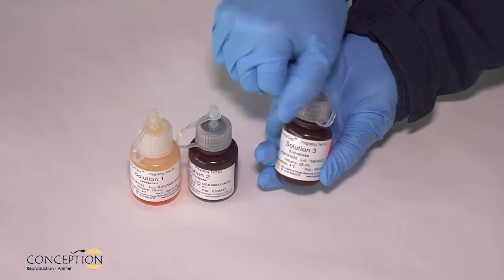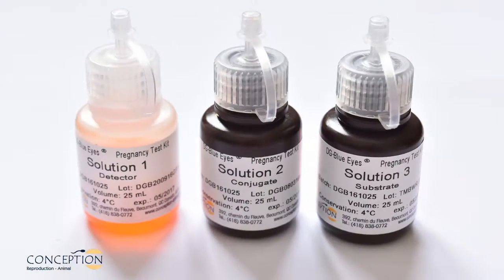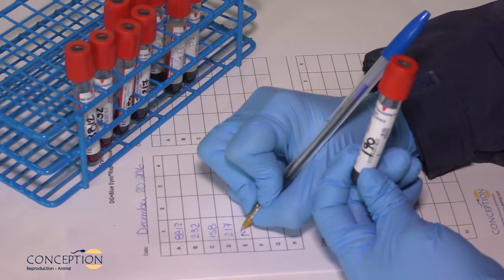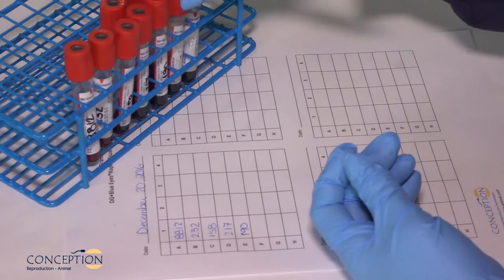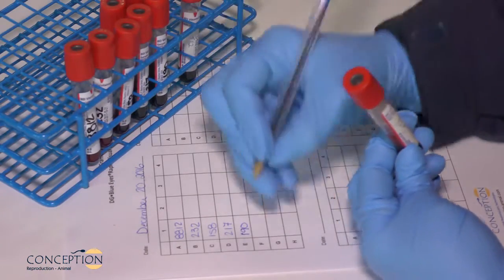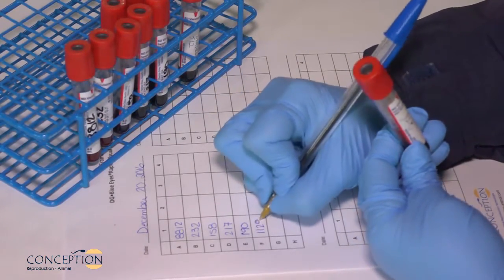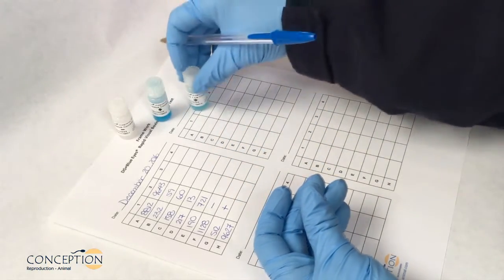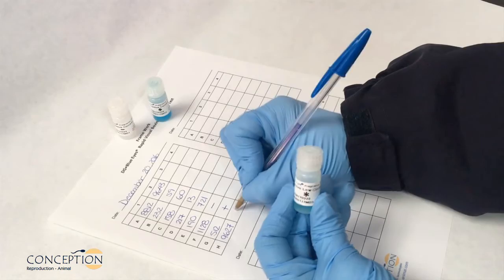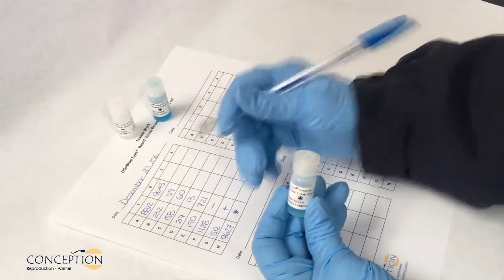When using the kit for the first time, put the drop dispenser caps on the bottles of solutions number 1, 2, and 3. Determine the number of strips required to complete the test by preparing your framework. Enter the test date, the identification number of animals to be tested, and add the three quality controls at the end of your test: negative, positive, and positive low controls.